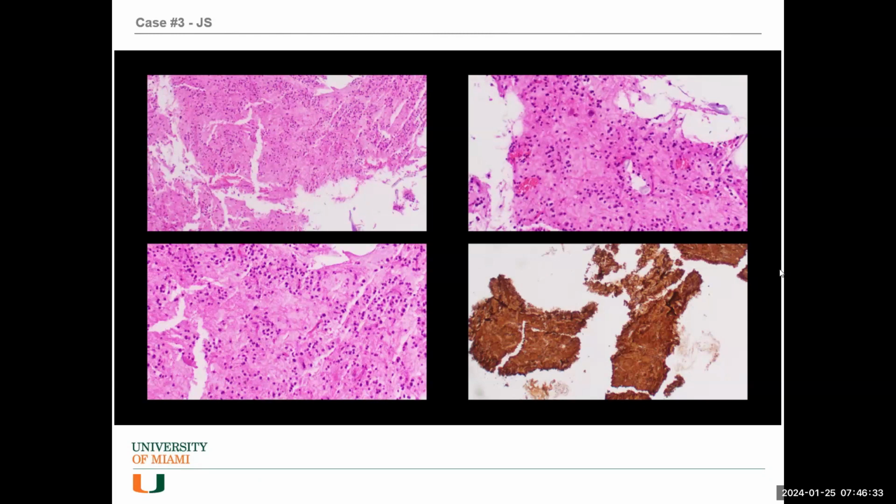And on the upper right picture, there's a big neuron-like cell at the mid-top. Myxoid background, rosette-like structuring, small round cells, no mitotic figures, no attributes of malignant behavior: necrosis, vascular proliferation, mitosis, etc.